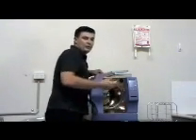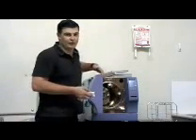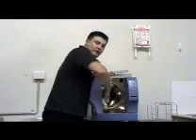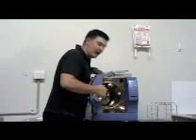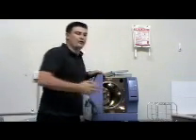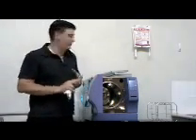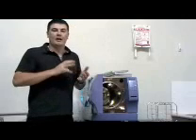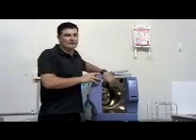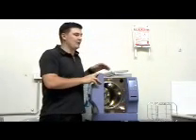So once a week or once a fortnight, depending on operation, we clean down the inside of the chamber, the inside of the actual door itself, and the door seal. Okay? You should never require chemicals or alcohols or so forth on your chamber. Anything that does come in contact with the chamber should clean off with a little bit of elbow grease.